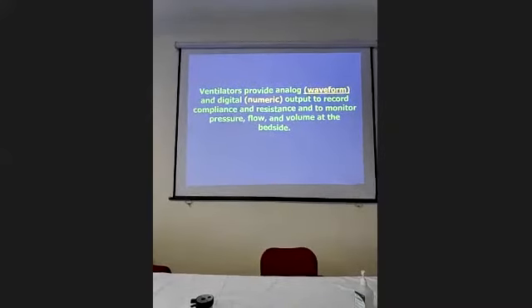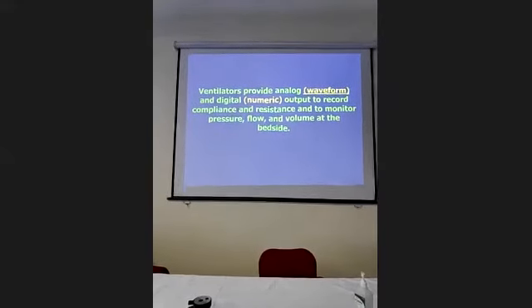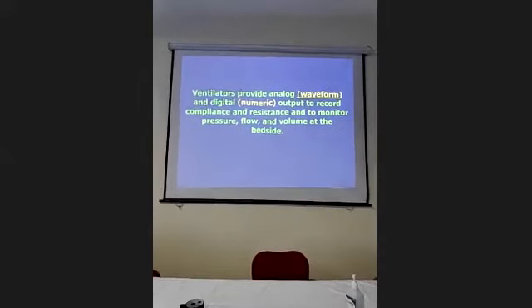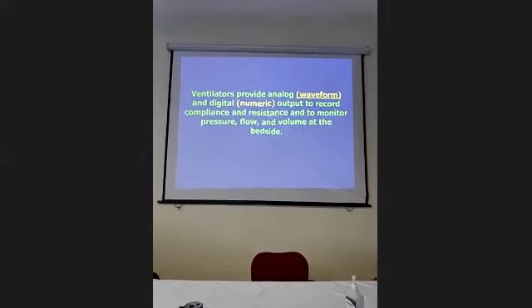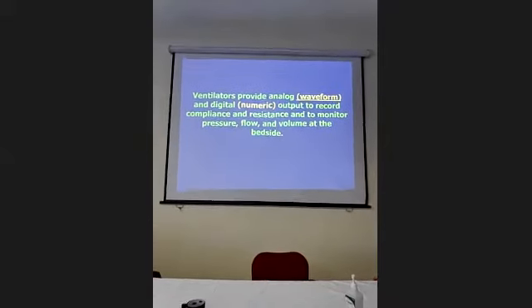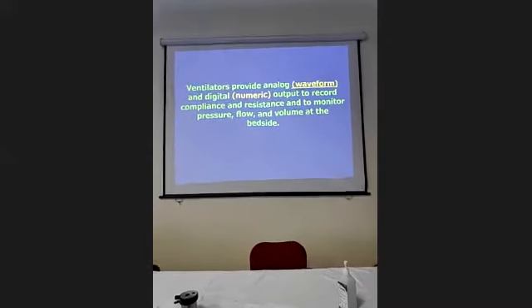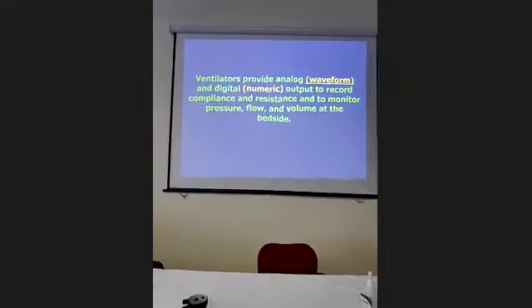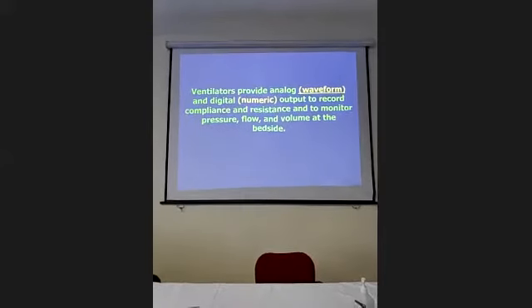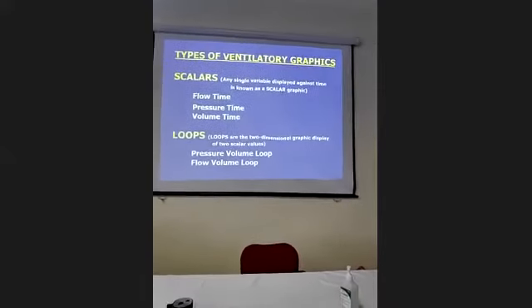Similarly, it is the graphical representation of the lung parenchyma, what is happening inside the lungs. We have to understand and catch from it what problem is happening with the compliance and resistance of this patient. These are reflected in a numerical manner also after getting measured. So we can see it in the waveform or in a numerical manner.